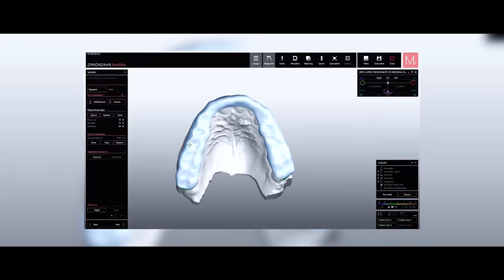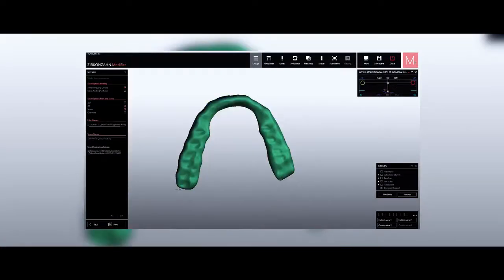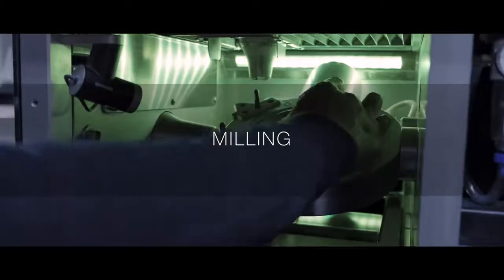Following the wizard step by step, we get to the final design phase, ready to start the milling process. In the Zirkonzahn Nesting software, we place the virtual restoration in a material blank and start the milling. As a material, we used Therapon Transpa, which is ideal for making bite splints and surgical guides, and then we milled a prototype in the M1 Wet Heavy Metal milling unit.